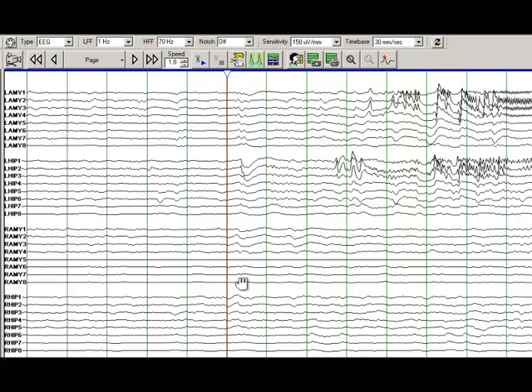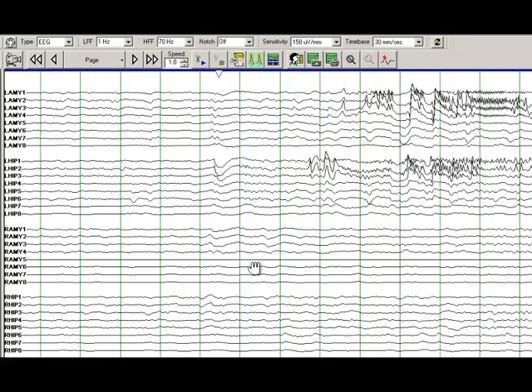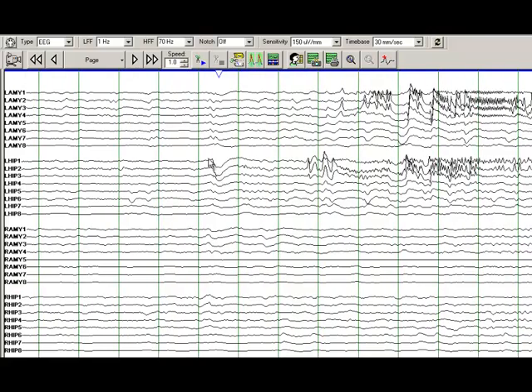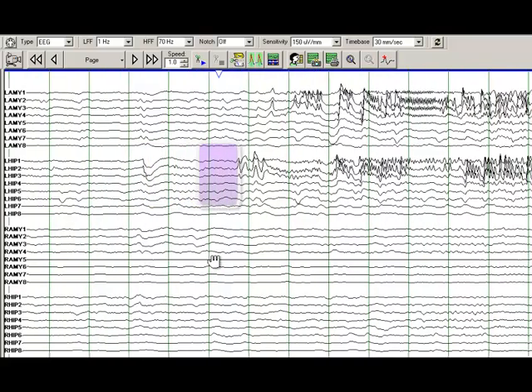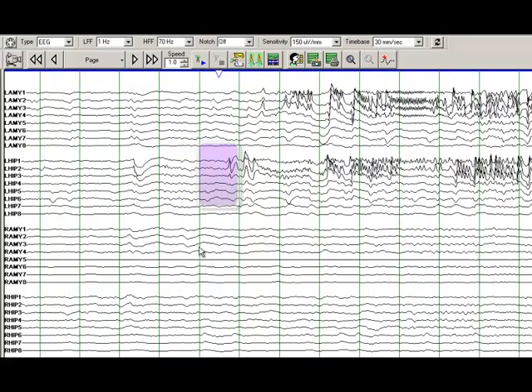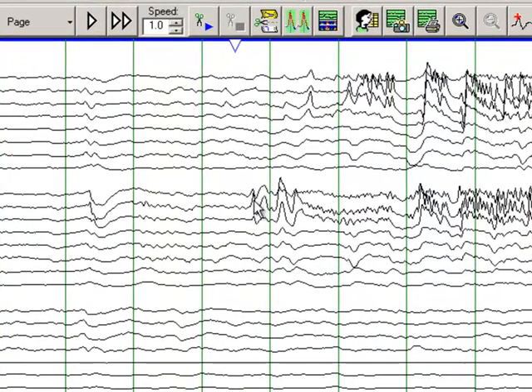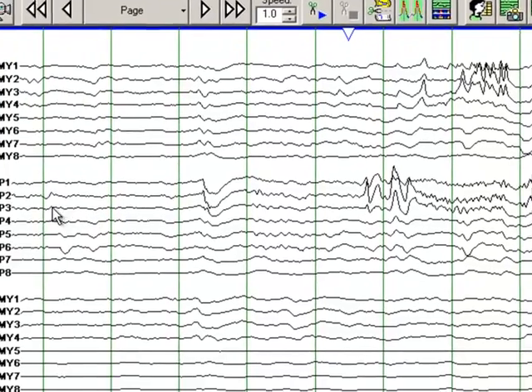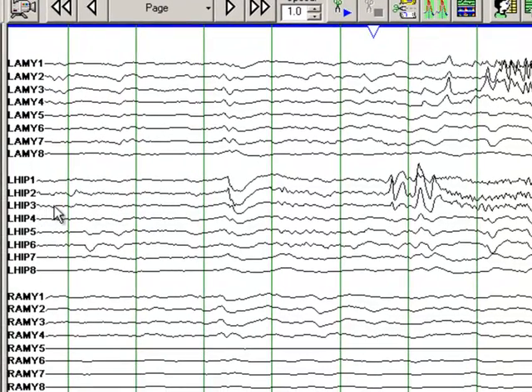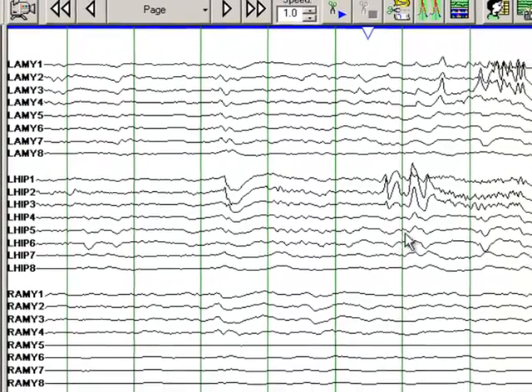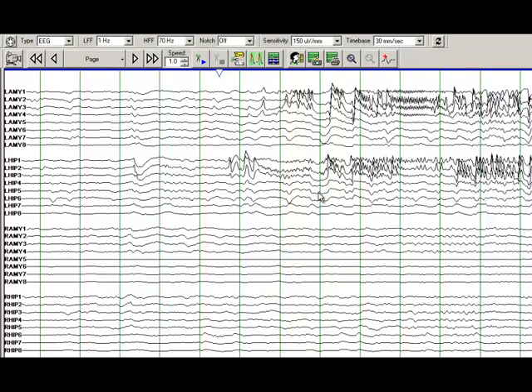So here we are at the seizure right at the time of the seizure onset. I'll take off this cursor. You see a discharge here, so this is an epileptic spike, and the electrographic seizure onset is from contacts one, two and three. The highest amplitude in fact is contact two of the left hippocampal probe. And these green lines are separated by one second, very similar to what you see on the scalp recordings.